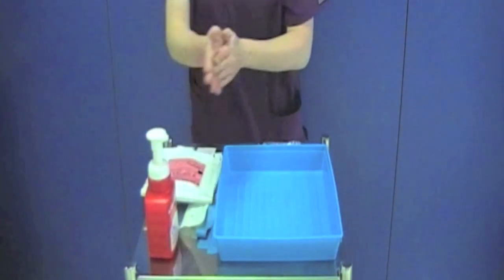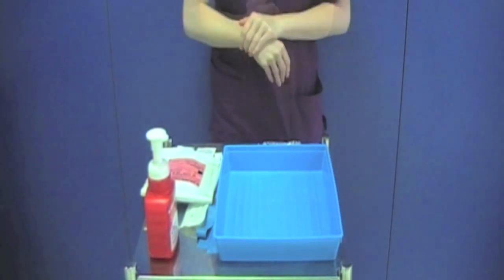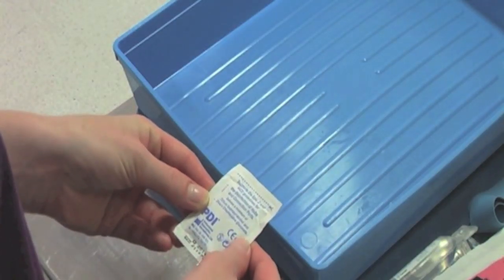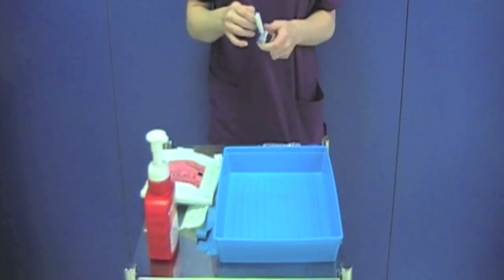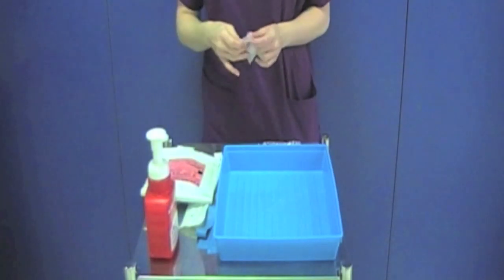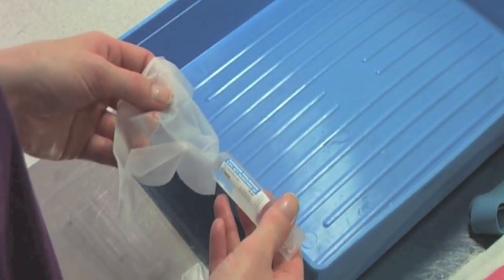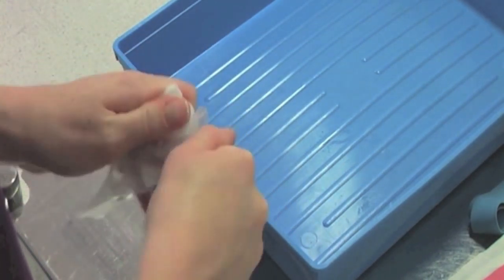You must now decontaminate your hands. Check that all of your equipment is in date. Open the chlorhexidine wipe. The saline must be checked by 2 members of staff. Clean the neck of the saline bottle and allow this to dry.